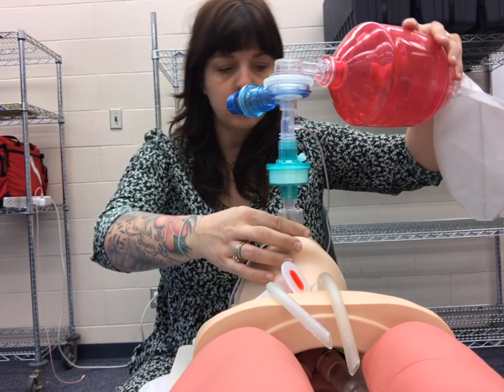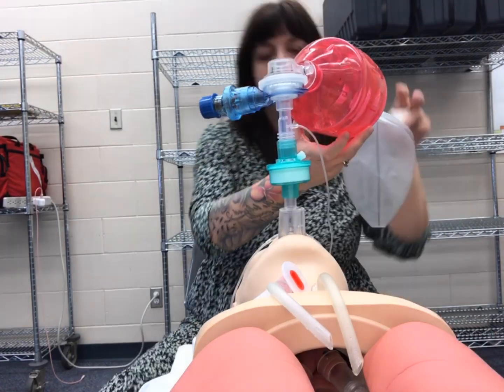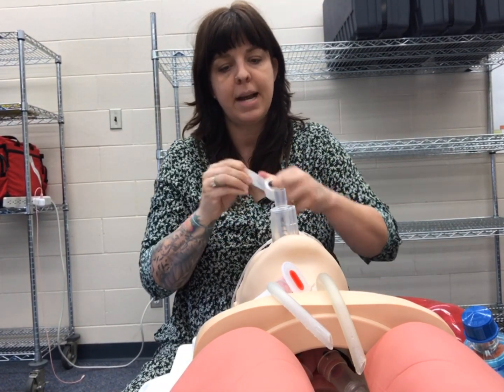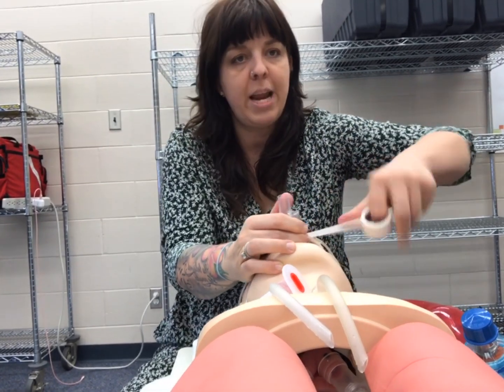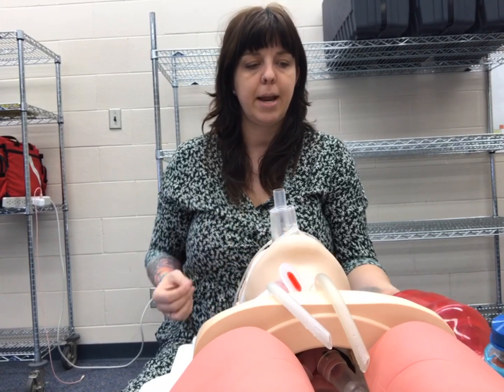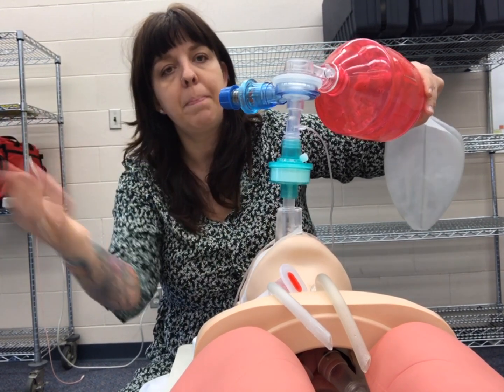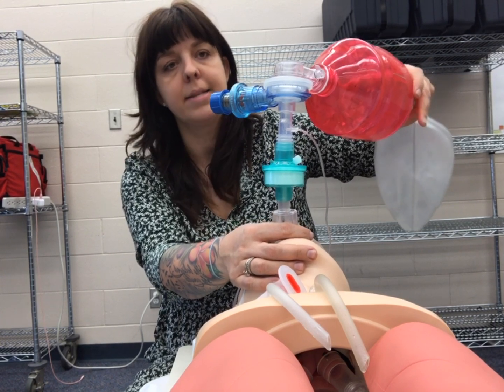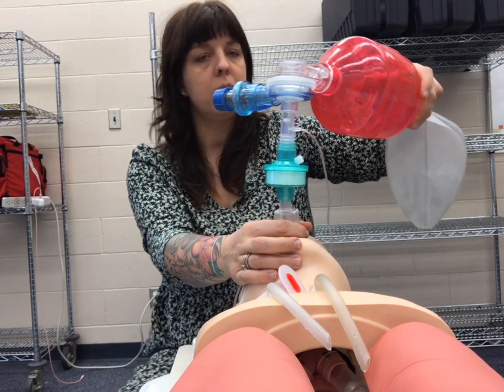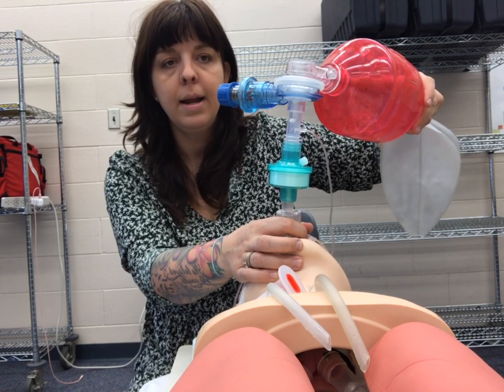Once confirmed, tape down the tube — keep the roll connected rather than using multiple small pieces. Wrap around the tube to the other side of the face. Now, when someone hasn't been breathing for a while, CO2 builds up. CO2 combines with water in a chemical reaction and becomes carbonic acid, which dissociates into bicarbonate and hydrogen ions. Those hydrogen ions build up and make the blood acidotic.